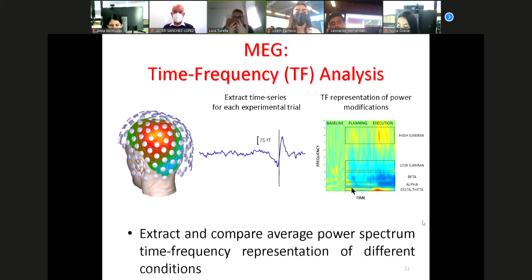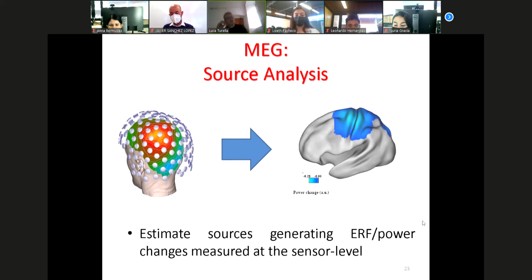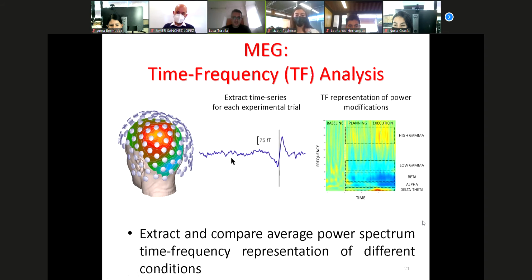And as in cognitive neuroscience, we are interested in understanding how the brain processes information, and time is a crucial aspect of this. For me, this type of representation was like a new starting point for my research. Up to now, I mainly described to you information that can be extracted with the specific sensor. So as I said before, the participant is inside this sort of helmet, and we are recording the information from this specific sensor, and we analyze the data here.